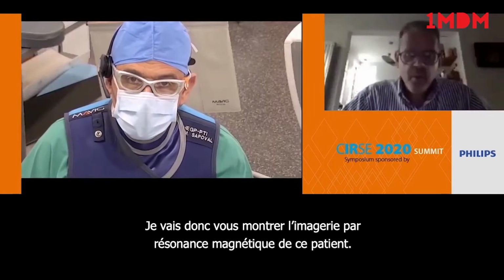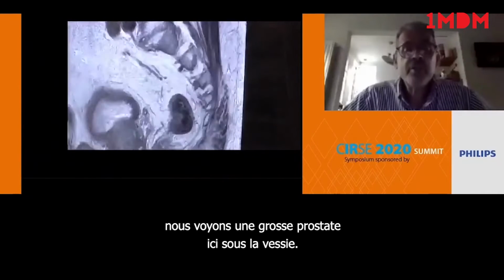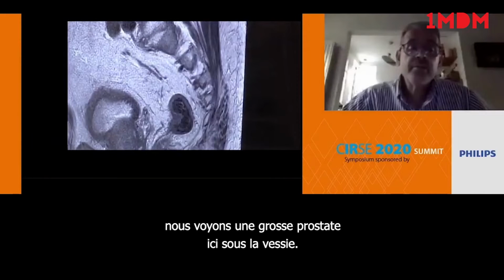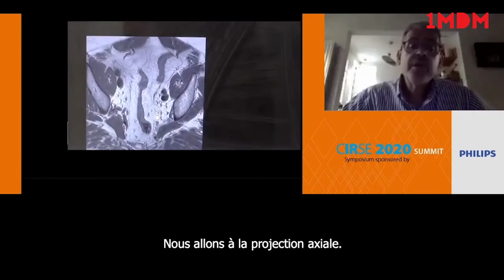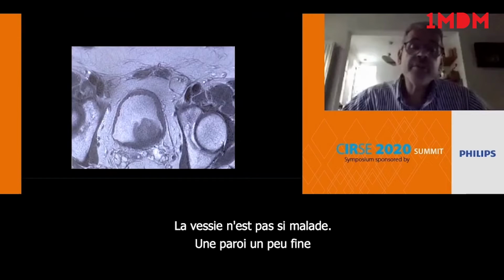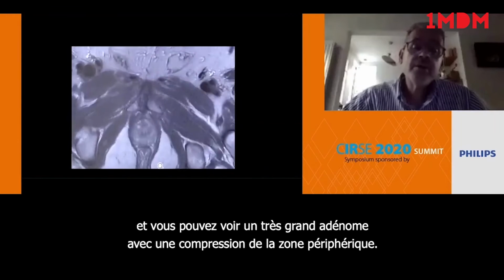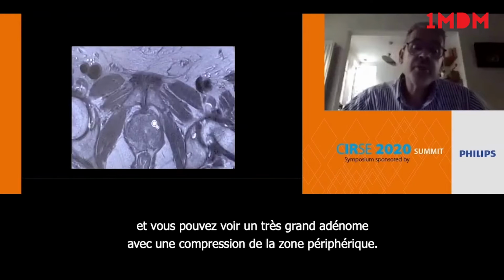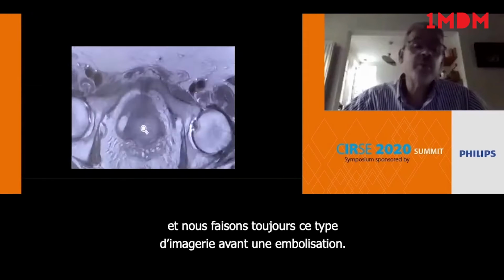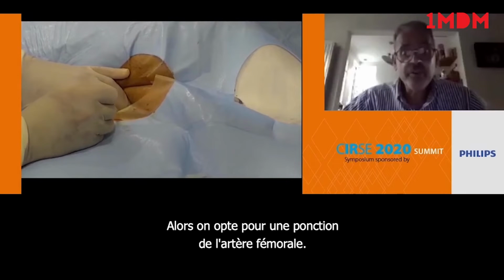So I'm going to show you the MR of this patient. You can see on sagittal imaging, we're seeing a large prostate here under the bladder. We are going to axial projection. There is a large left lobe which is protruding into the bladder. The bladder is not so diseased, a little thin wall. And you can see a very large adenoma with compression of the peripheral zone. This is quite usual when we do PAE and we look at the MR, and we always do MR before embolization. So we go for femoral artery puncture.